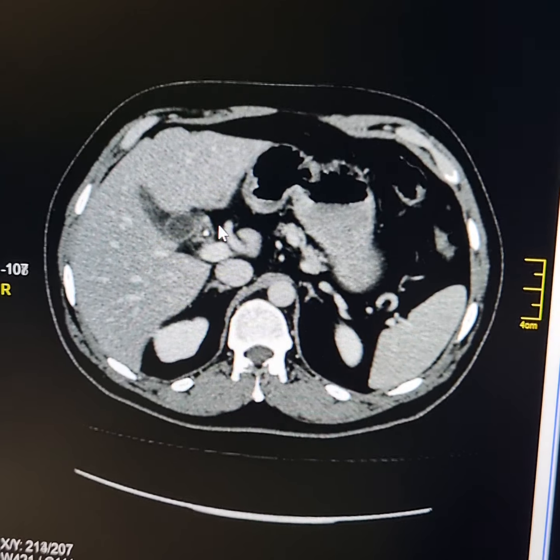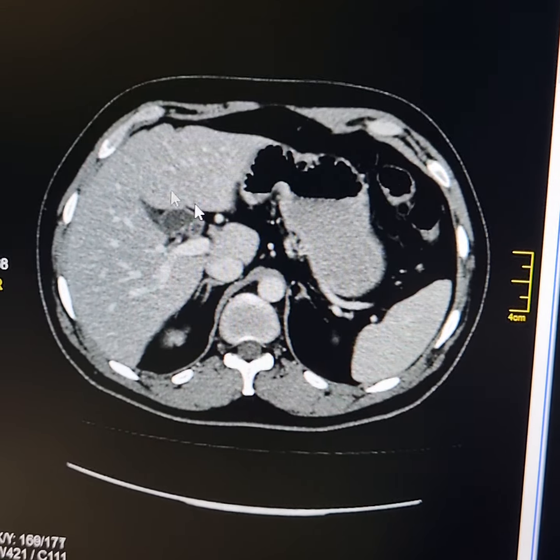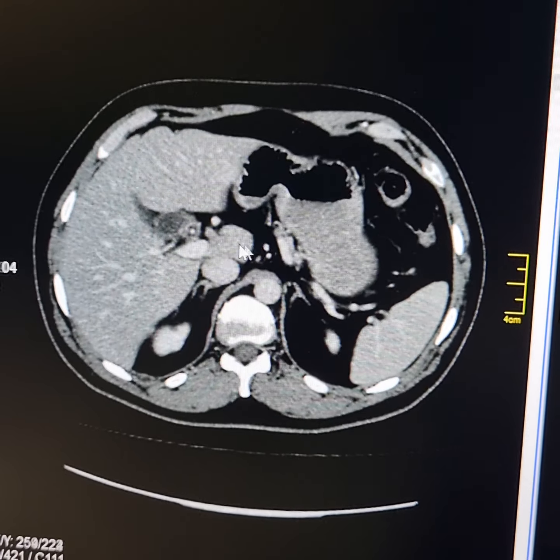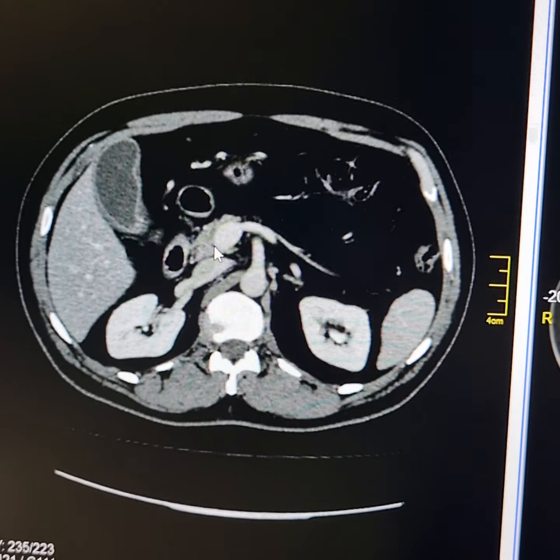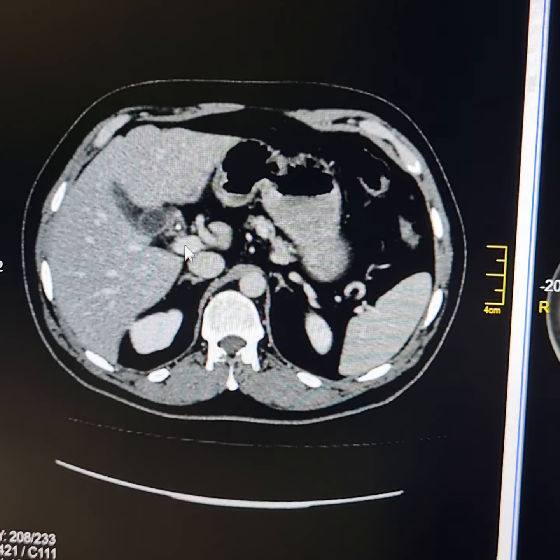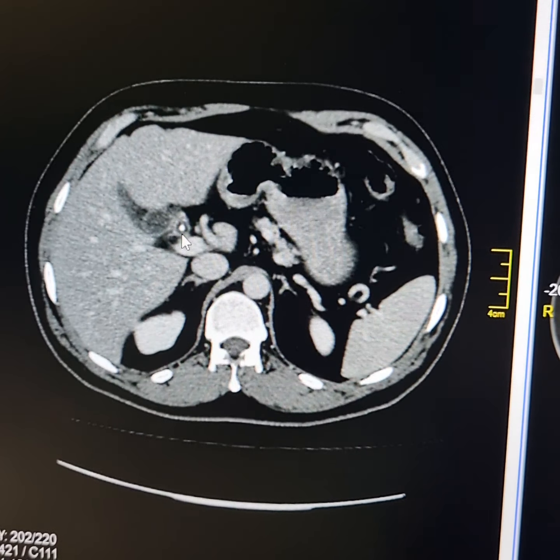We must dip down in the subcostal region or from the right side to look for the neck of the gallbladder once it is distended, because there is always a likelihood of missing such small calculi lying in the region of the neck of the gallbladder if the patient is obese or thick.